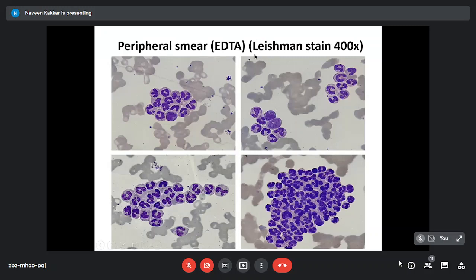So what is this? EDTA-induced leukoagglutination. The white cells are stuck together. So again, the very big ones will be edited out. They won't be counted at all. The smaller ones gradually will be undercounted. Single ones are counted more accurately. Most of the big ones will be edited out and not counted.